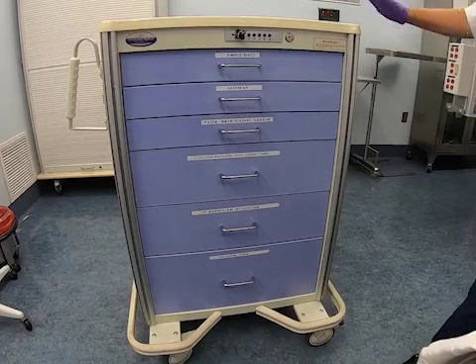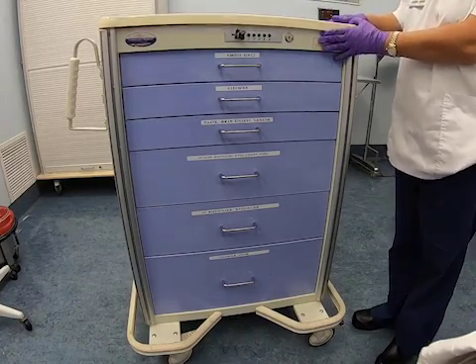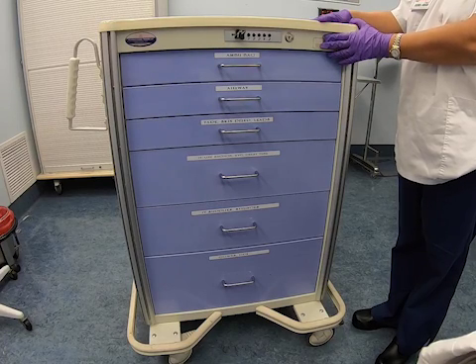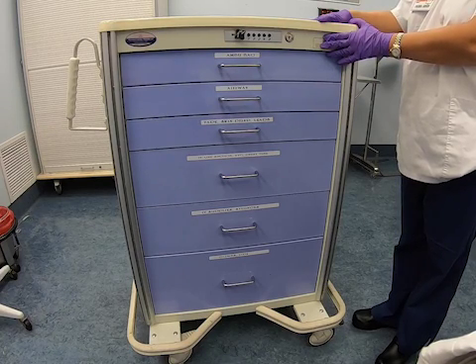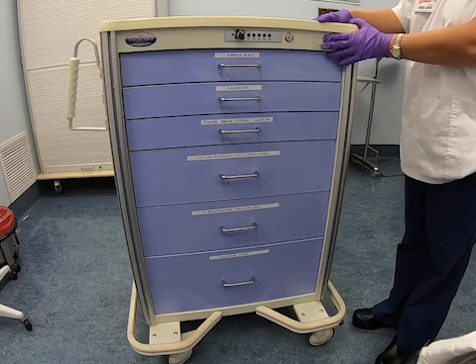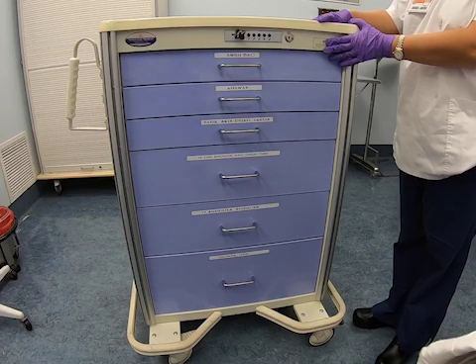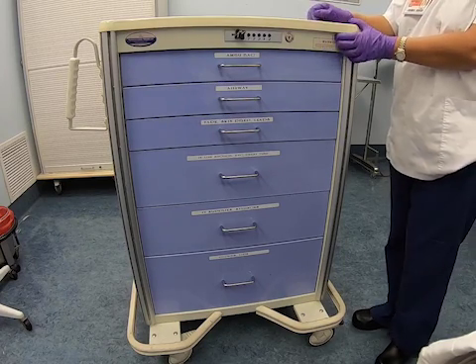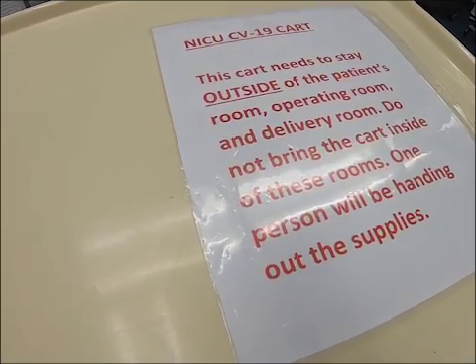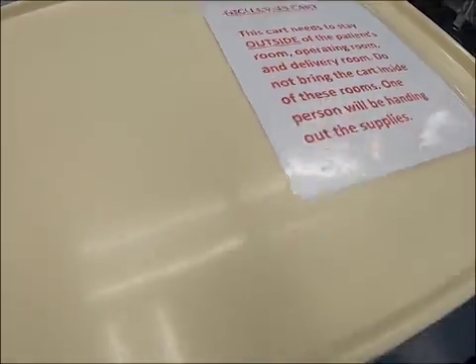This is the NICU CV19 cart. The purpose of this cart is to store essential supplies for airway management and resuscitation of neonates born to a woman who is suspected or confirmed for COVID-19 infection. This remains outside of the woman's birthing room to avoid contamination. A designated staff member will hand supplies to the staff who will receive the baby in the room.